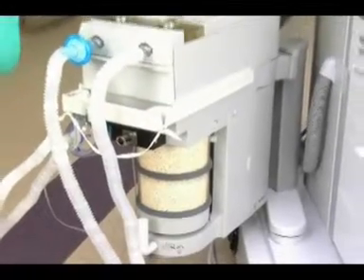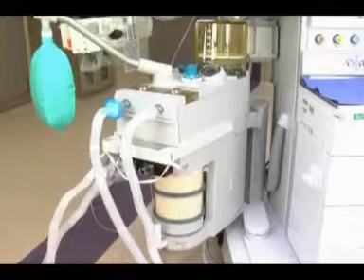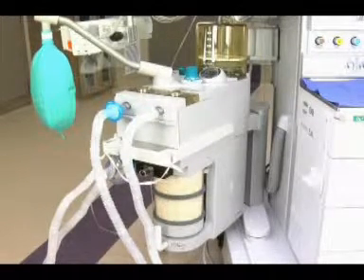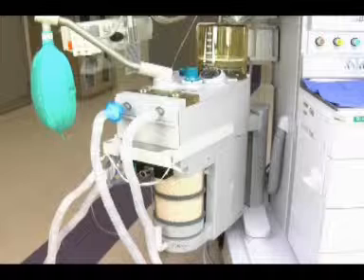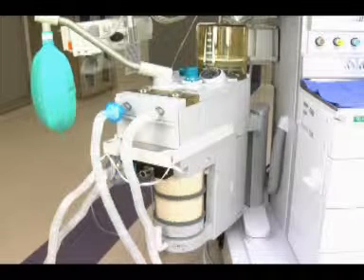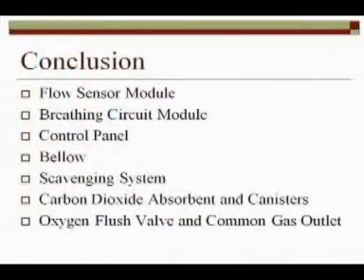This concludes the breathing system of the anesthesia machine. There are other parts that are hidden that we did not go over. Here at KUMC, if there are problems with the anesthesia machine, there is a team that knows the machine very well. But if they are not available, just remember that on the breathing system, it can come apart without any tools and be put back together as long as all the seals are lined up correctly.